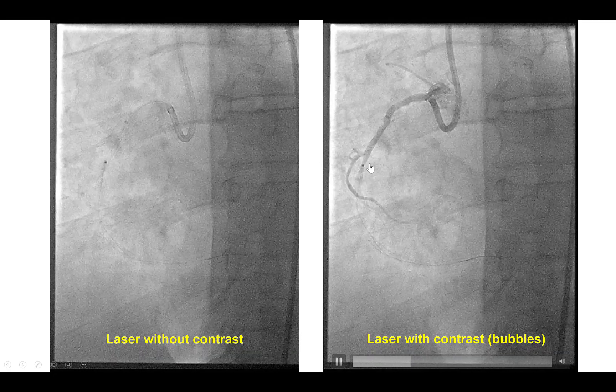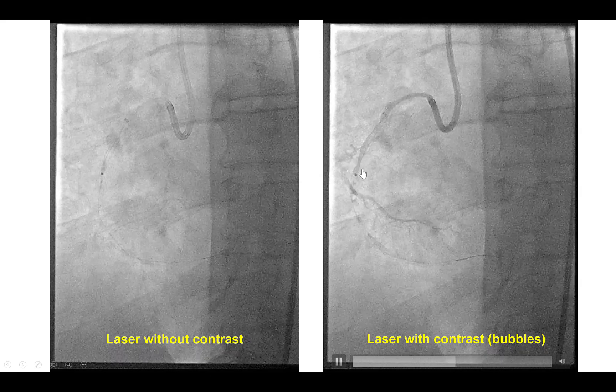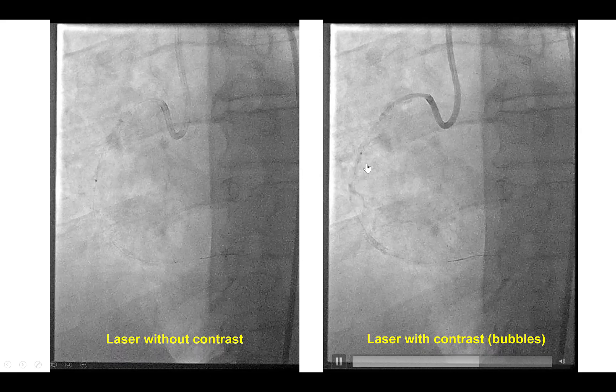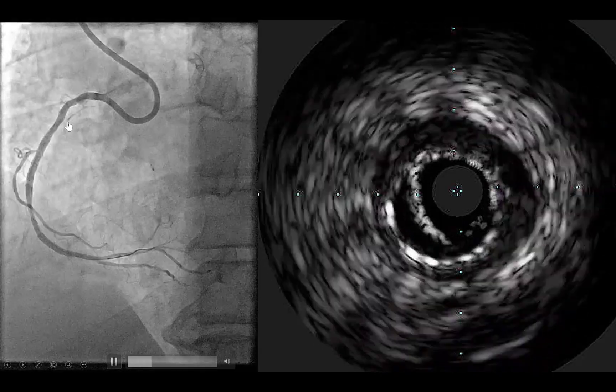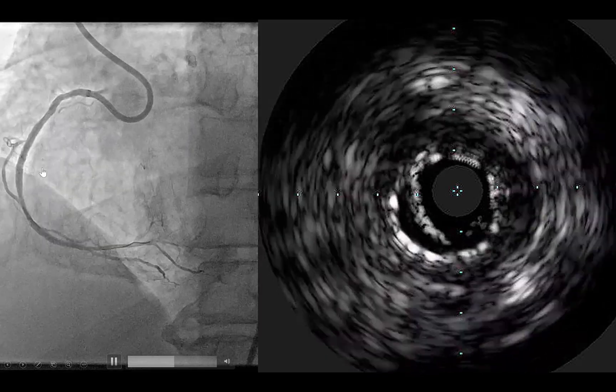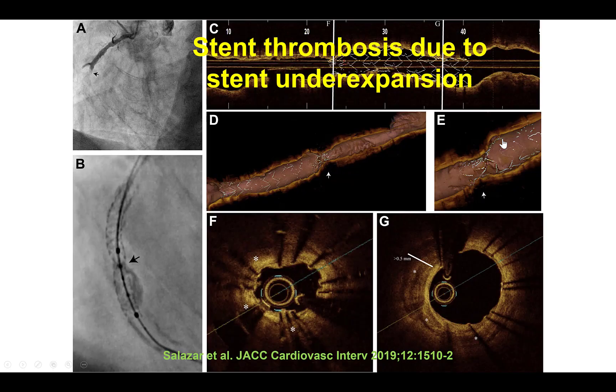In this particular patient, laser with contrast was used, which successfully expanded the stent, both angiographically and by intravascular ultrasound.